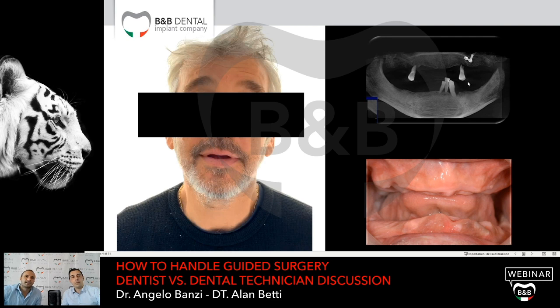I extracted all the teeth, and after healing of the soft tissues, I'm ready to start with the guided template, with the guided procedure. Why? This is really important. Second point is having static soft tissues.